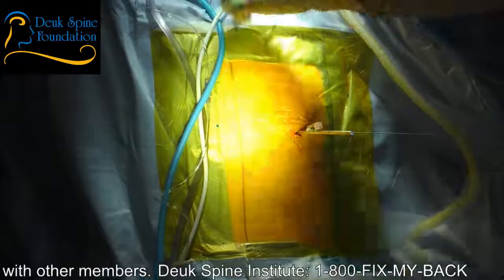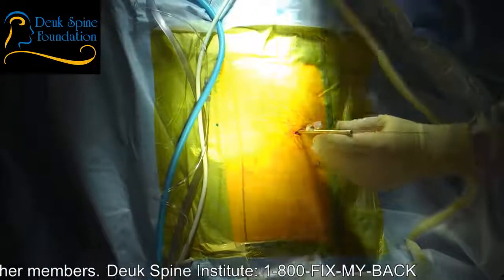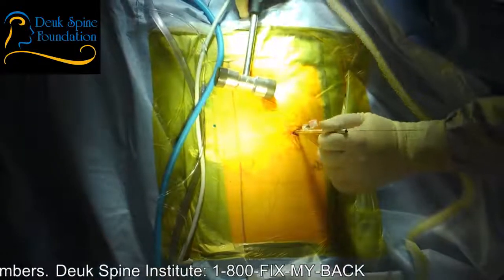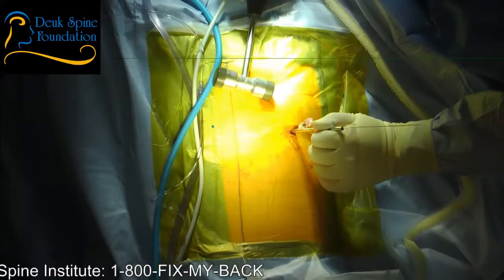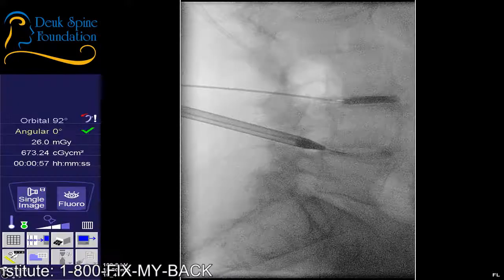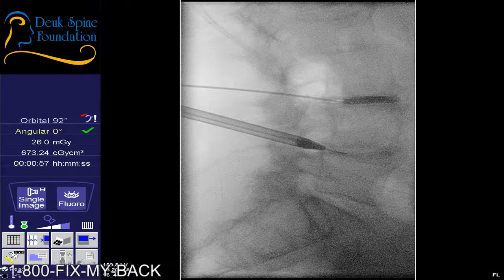All right, just let me check something here, because the guide wire is coming out the back end, which is fine. But let's see if I can advance this now without the guide wire, because I'm going to start trapping the guide wire, which I don't want to do.